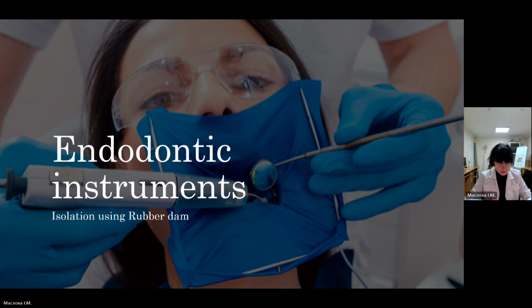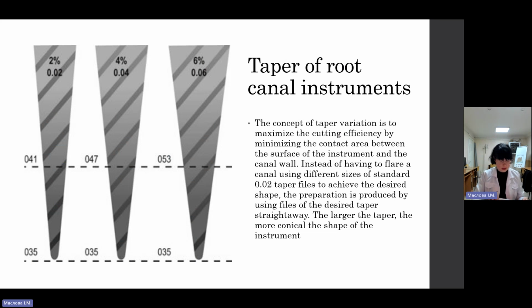Hand instruments. After the isolation of the working field, the dentists have to use hand or machine endodontic instruments. Hand instruments you can see on this slide. A scheme of the hand instruments you can see on this slide.